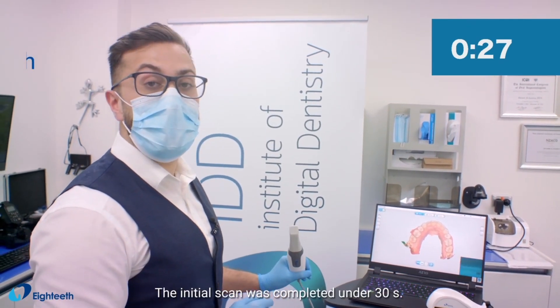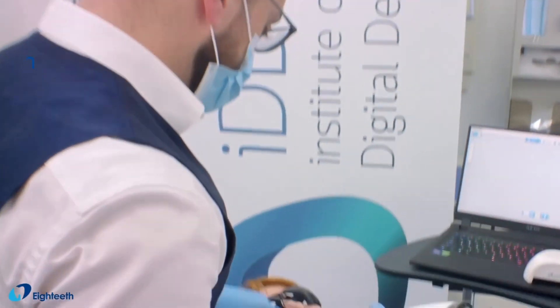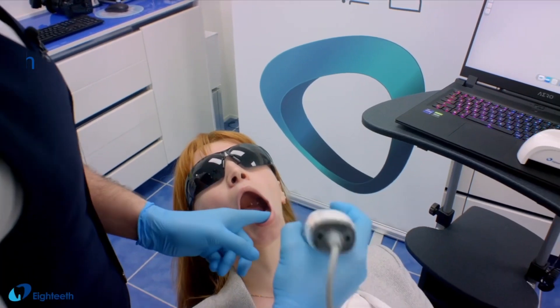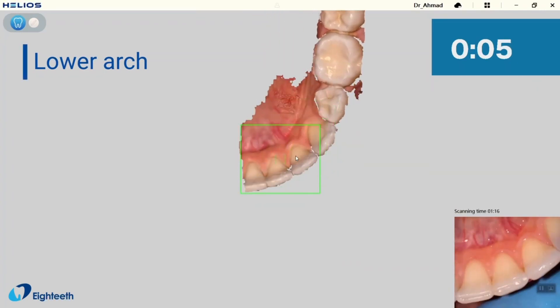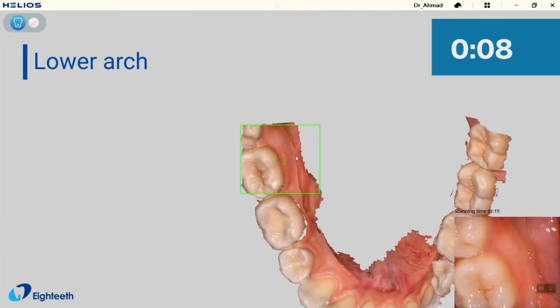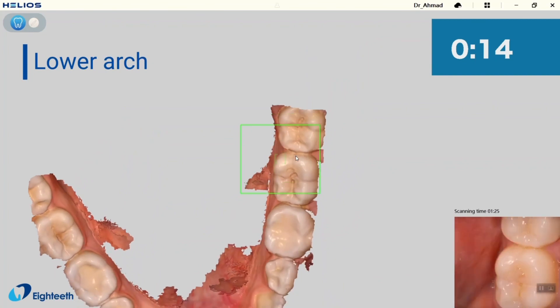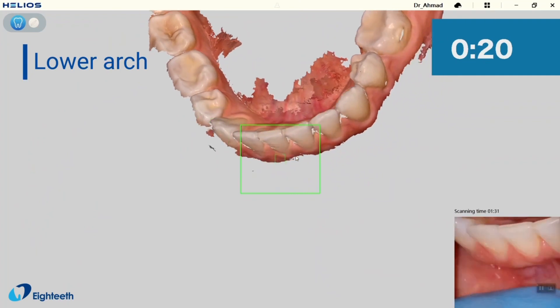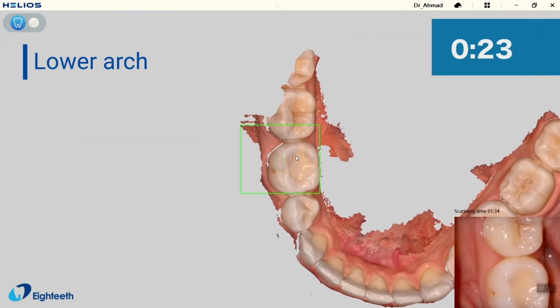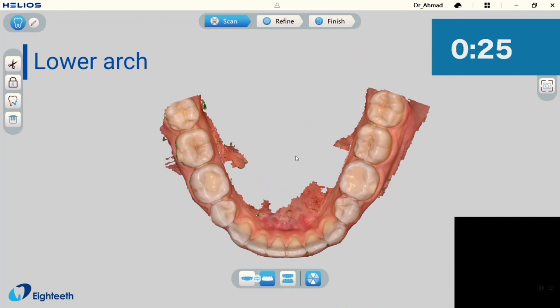The initial scan was completed in under 30 seconds. Now let's scan the second arch, which is the mandibular arch. That's another full arch scan completed easily in under 45 seconds.